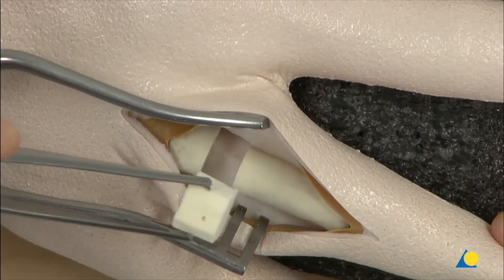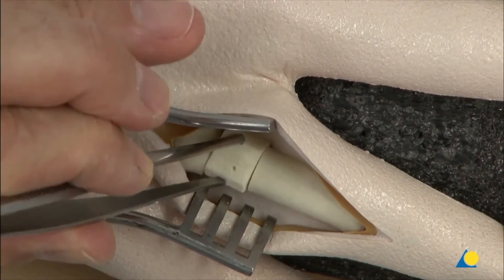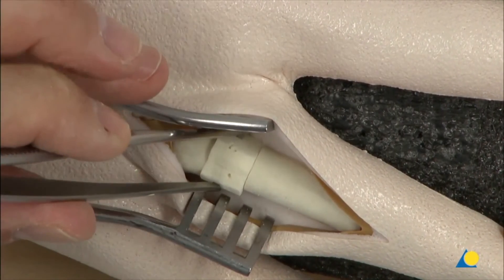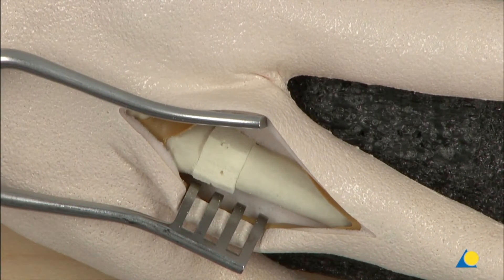To fill the bone defect, a bone graft is cut from a hard foam block. The graft is inserted into the defect after rounding off the dorsal margin. When a corticocancellous graft is used, the cortex should lie on the palmar side opposite the plate for optimal stability.